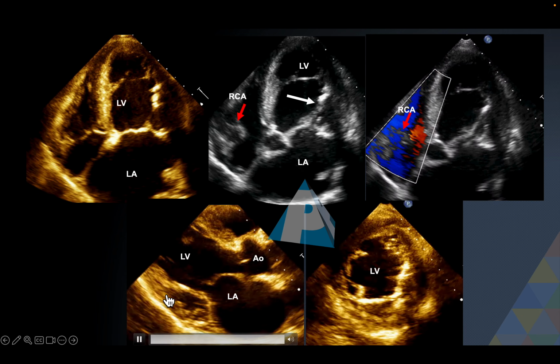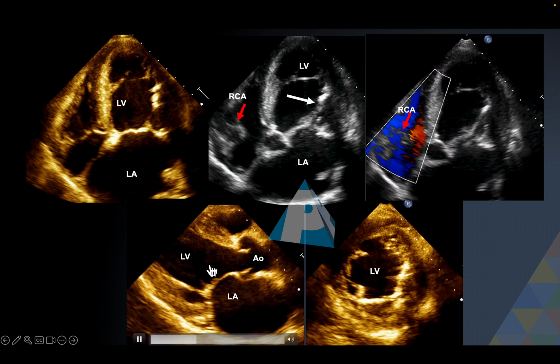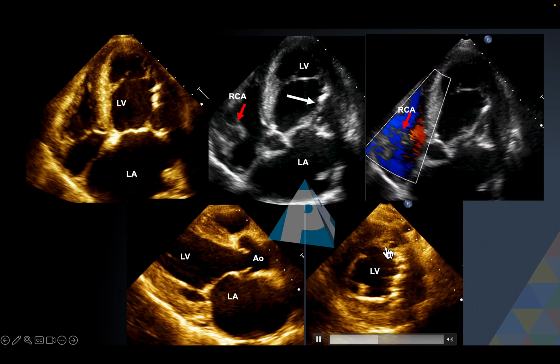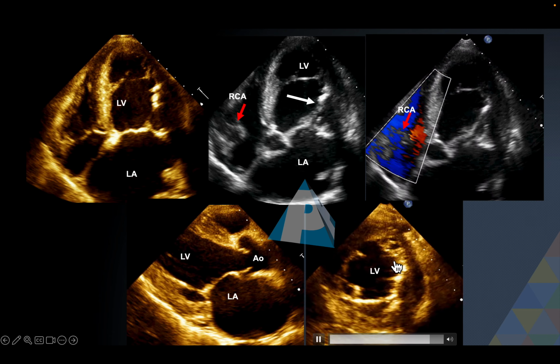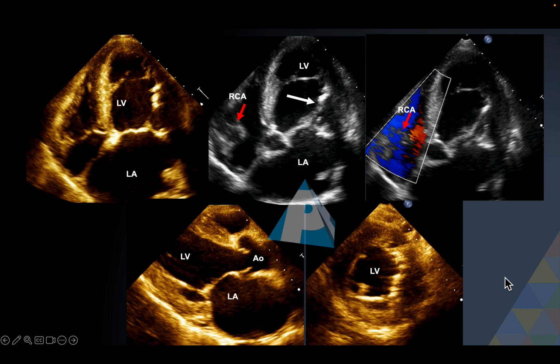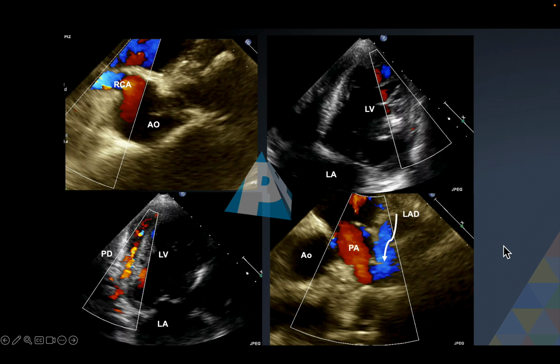Here you see the mid posterior segment is slightly more hypokinetic, the EPSS is less, and the ejection fraction is about 33%, and you see the calcification in the endomyocardium. The reason is global ischemia of the entire myocardium. This calcification and fibrosis is very peculiar for ALCAPA rather than other atherosclerotic coronary artery diseases.